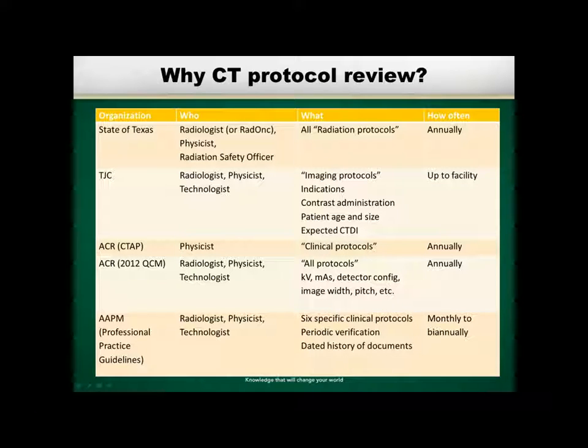A monthly review of all protocols, I think everyone would agree, is overkill. But monthly meetings where you're reviewing a few protocols is not a bad idea. And something that they consider all important is also a dated history of the documents. As you're making changes to the protocols, you document those changes and what protocols got changed and when and so forth. But this is the only thing where the word verification appears.